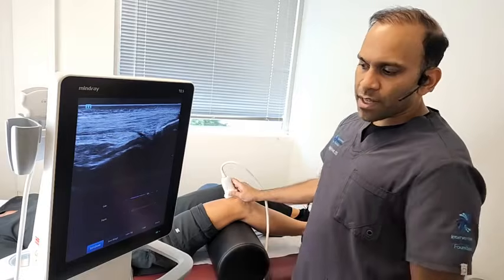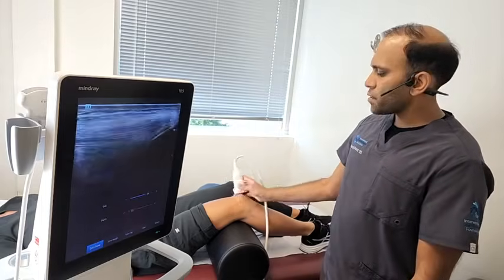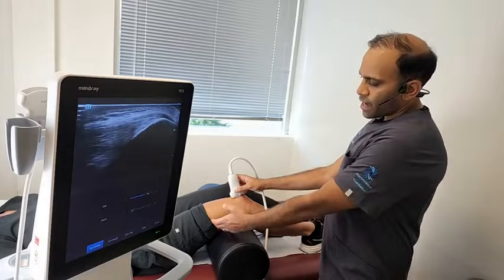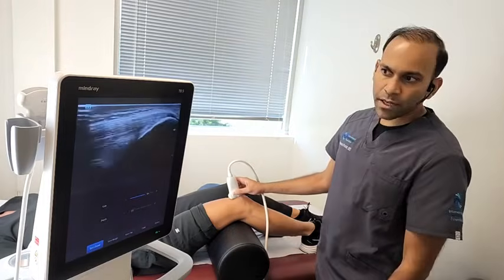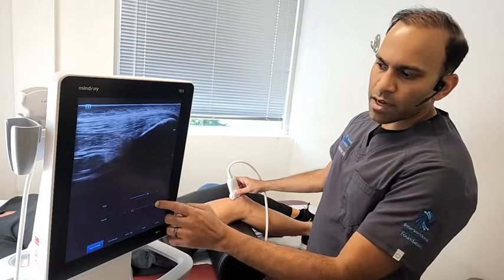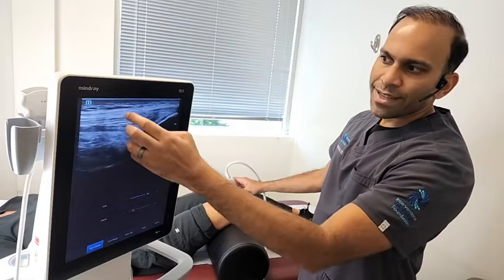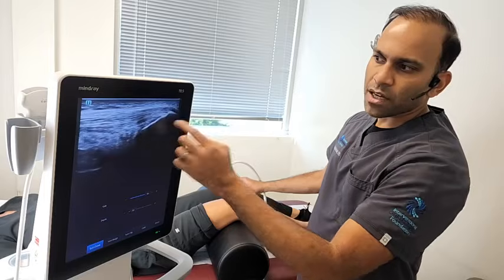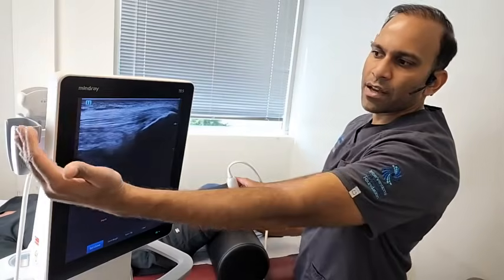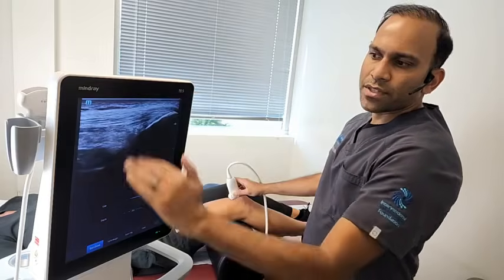So I'm going to get started with the knee here. This first image that we're looking at is at the front of the knee. If you can picture where I have my probe right here, this is the thigh, this is the lower leg, and this is the kneecap over here. When we look at this image, we can see that this is the thigh bone, this is the kneecap, and this is the thigh muscle called the quadriceps, the tendon of that quadriceps coming and attaching onto the kneecap here. Just for orientation, this is towards Lexi's head, this is towards her feet, this is superficial, so the skin over here, and this is deep.